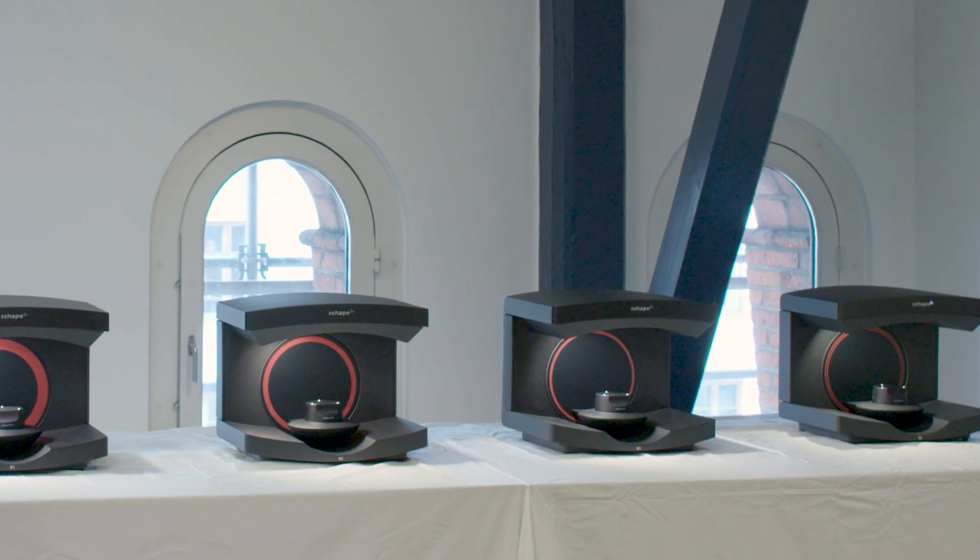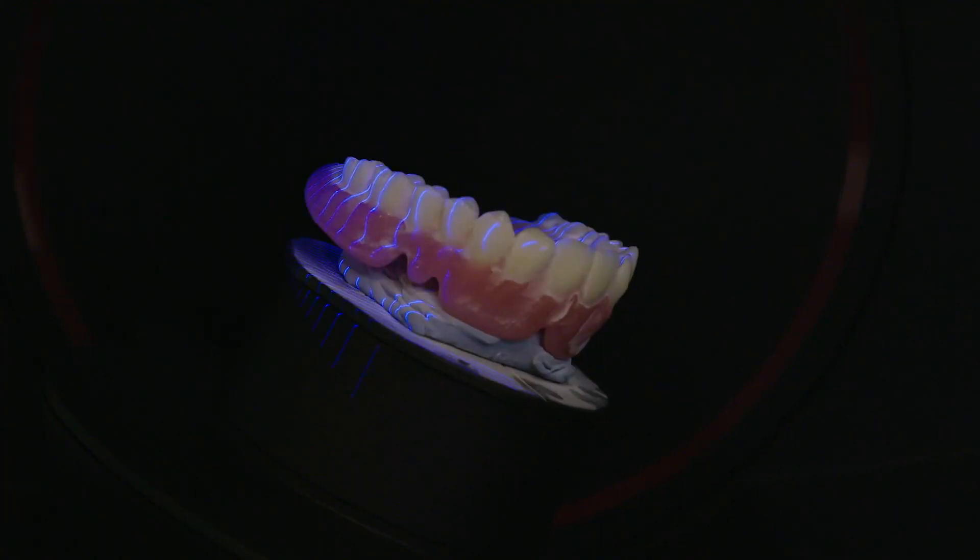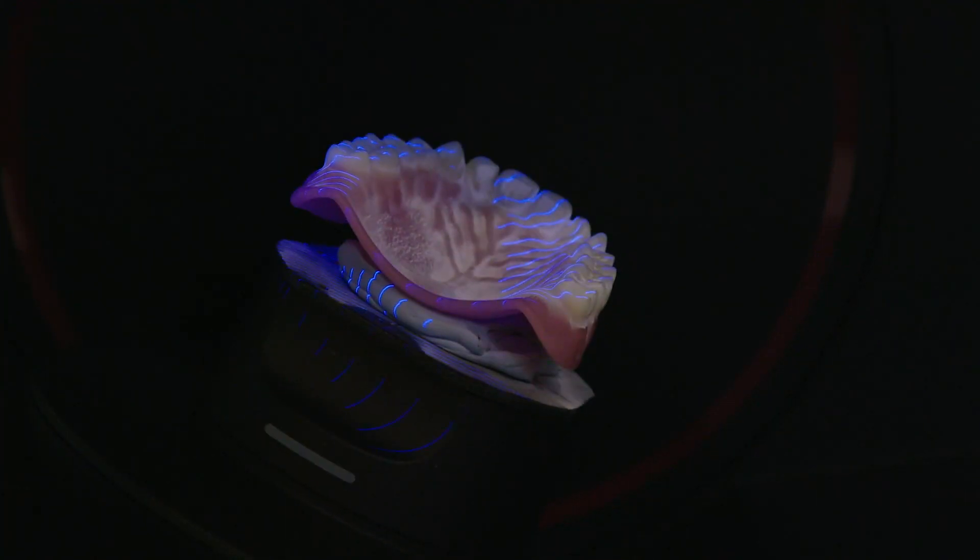With the Generation Red e-lab scanners, what we have essentially done is taken the e1, e2, e3 lab scanners and upgraded them to the same platform as the premium e4 lab scanners, and by doing so we've made the scan speeds 20% faster. So what you essentially get is the latest and greatest hardware and the increased speed both at the same time.